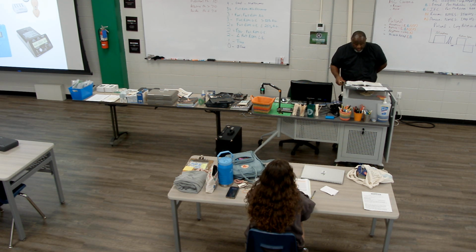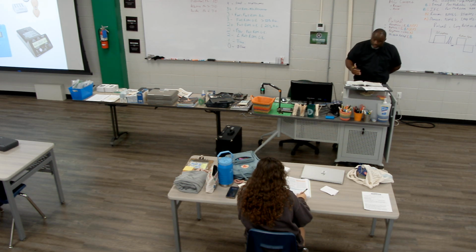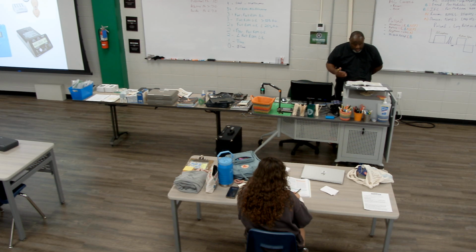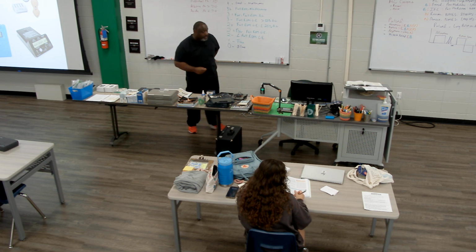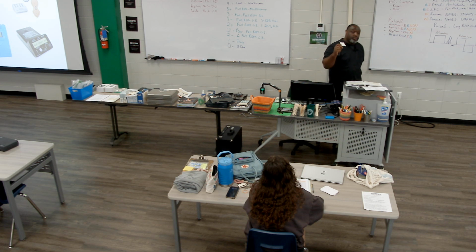It's either pre-programmed or programmable based on time, dosage, and what we're trying to accomplish. The drug applicator electrode may be selected as either the anode or the cathode. You're going to use it based on whatever the polarity is of the drug you're using.